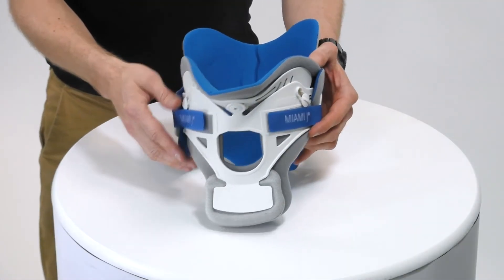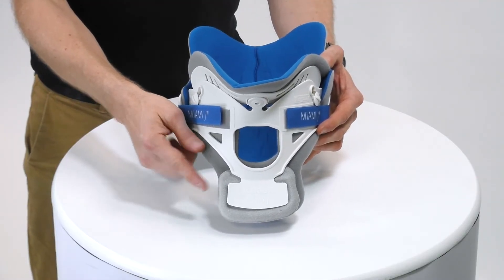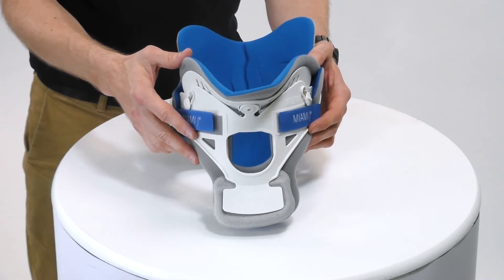At the front we have a large sternal plate, which distributes the pressure across the sternum and can be removed if the anatomy dictates.